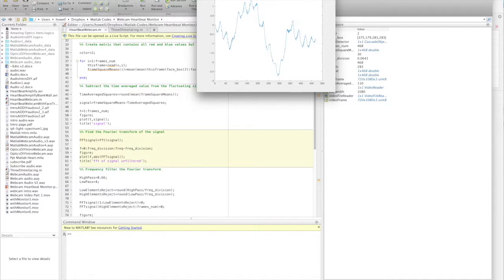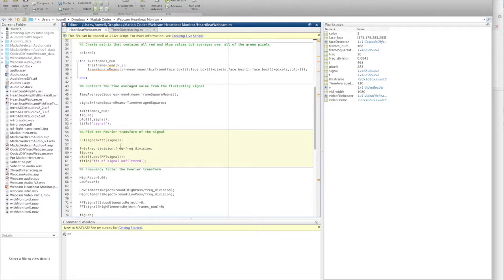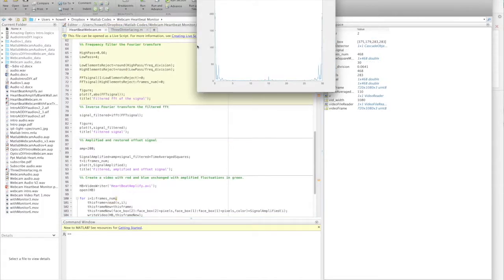In this section, we take the fast Fourier transform. The Fourier transform allows us to look at the frequency content of our signal. The heartbeat is a frequency that we measure in beats per second. A typical resting heartbeat is a little more than one beat per second. You can see the heartbeat frequency. In the correct units, this shows that there are strong fluctuations about every second.